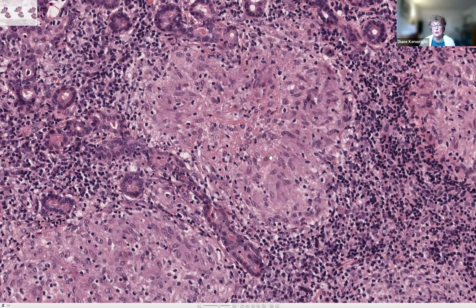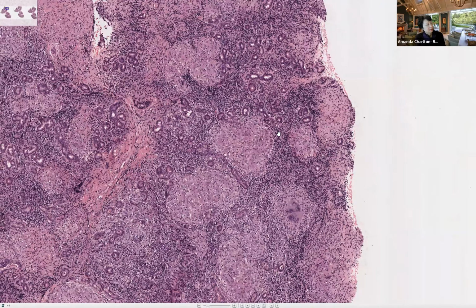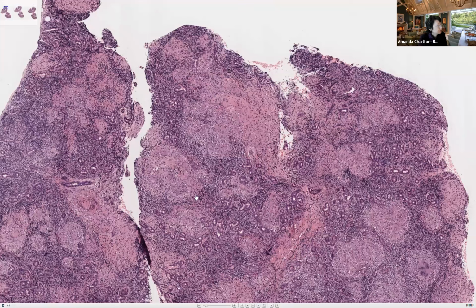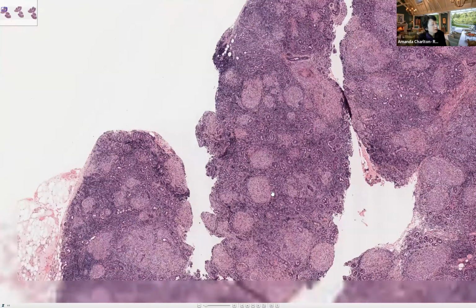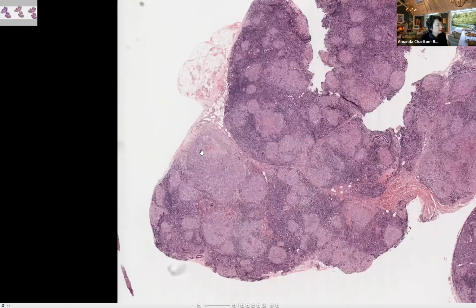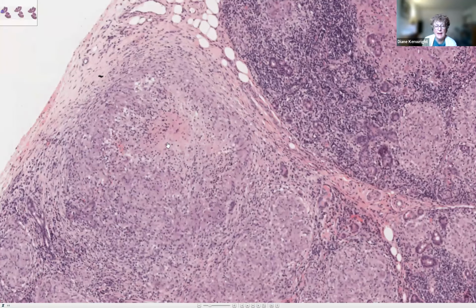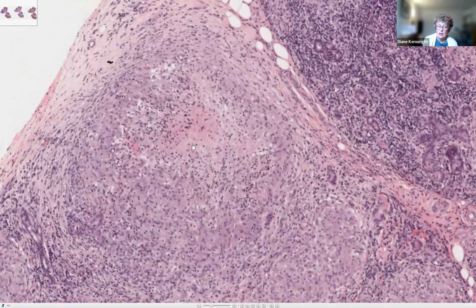Okay, so you were telling us about non-necrotizing. People, type in the chat, what did you see? And I'll see if I can search around and find some. So the ones that we looked at so far, non-necrotizing. Yeah. Well, what about over here? It is definitely non-caseating. So caseation is a subcategory of necrosis. So you can have caseating necrosis and non-caseating necrosis.